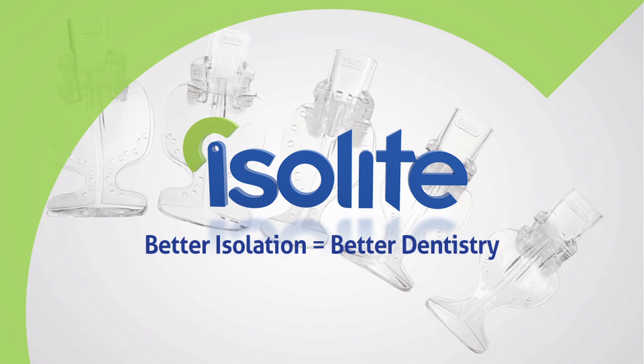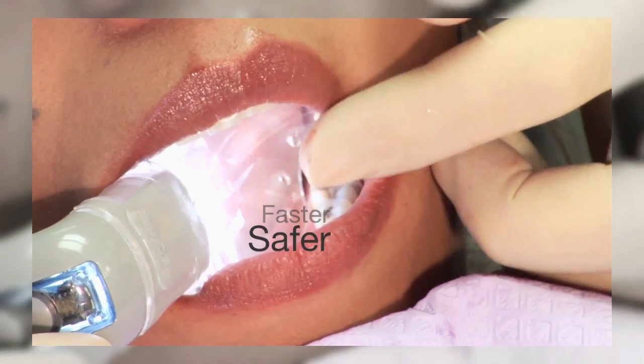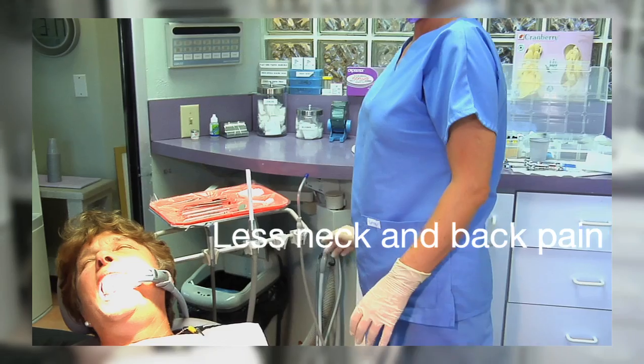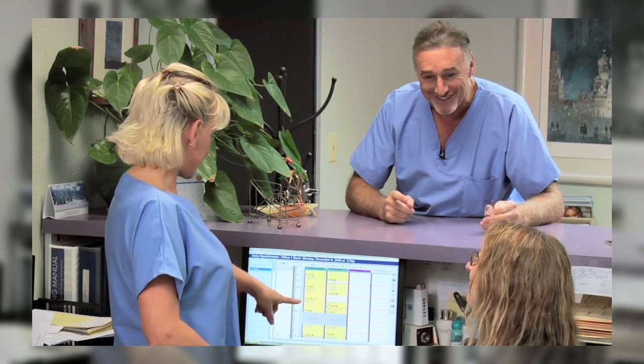At Isolite Systems, we believe better isolation equals better dentistry. Better isolation means faster, safer, more comfortable procedures for you and your patients. Less neck and back pain and less chair time per patient so that you can grow your practice.